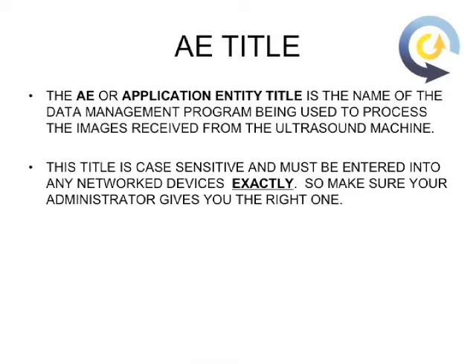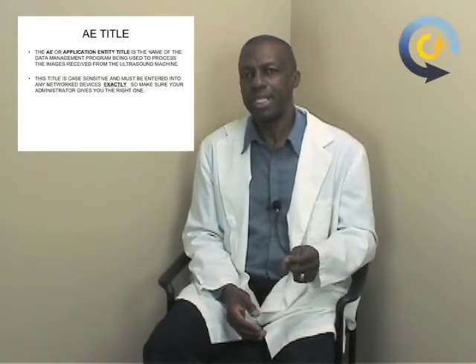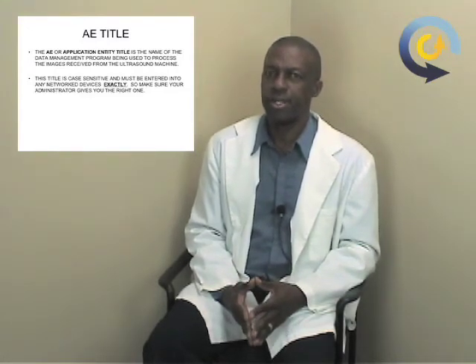AE title. The AE, or Application Entity Title, is the name of the data management program being used to process the images received from the ultrasound machine. This title is case sensitive and must be entered exactly as it is given to you by the network administrator. So make sure that when you receive the AE title, that it is accurate.